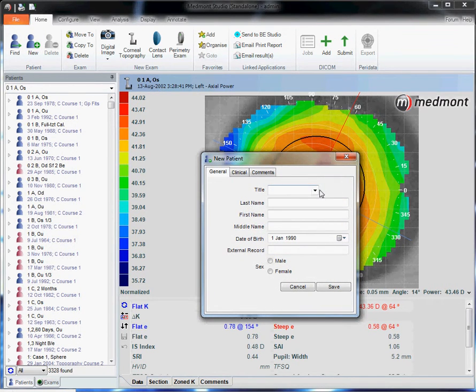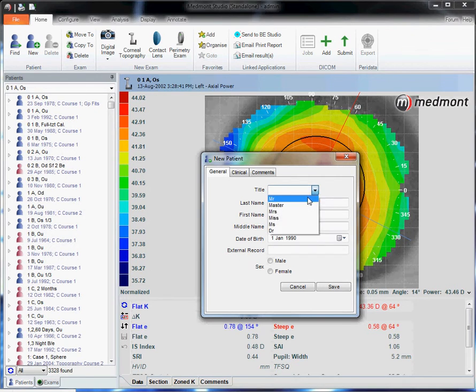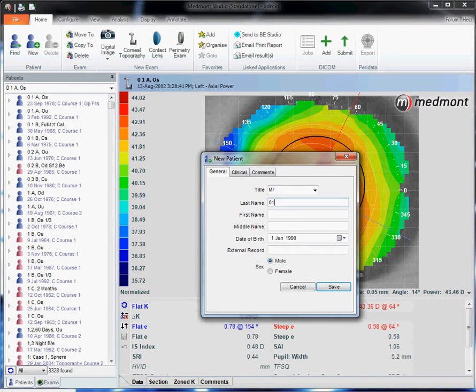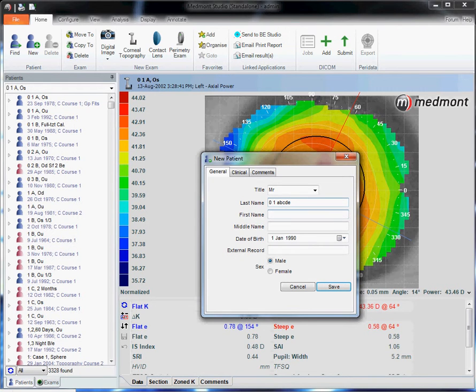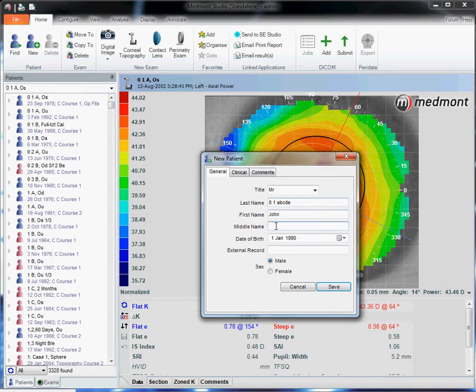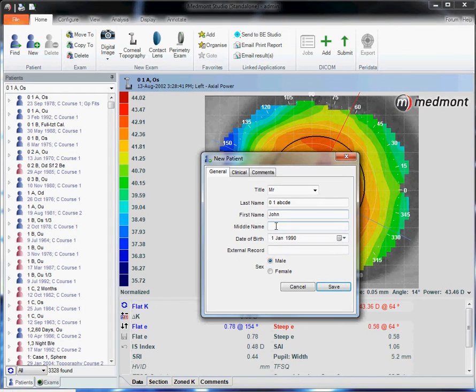Then enter in your patient information, last name, first name. Use the tab keys to scroll through the different categories or the shift tab key to go backwards.